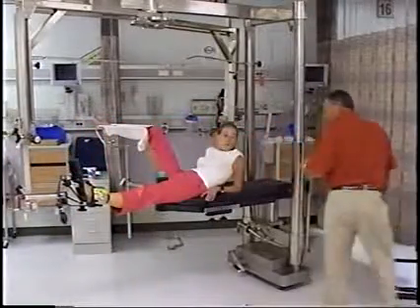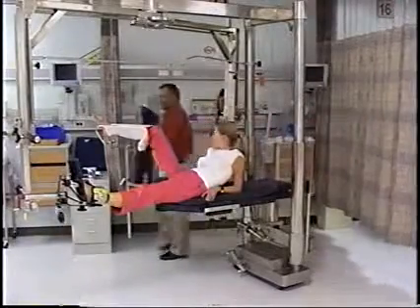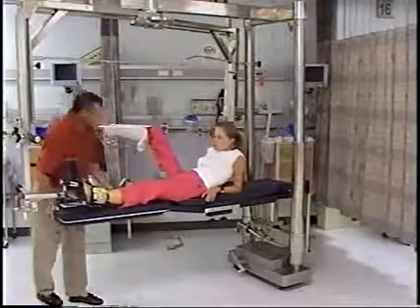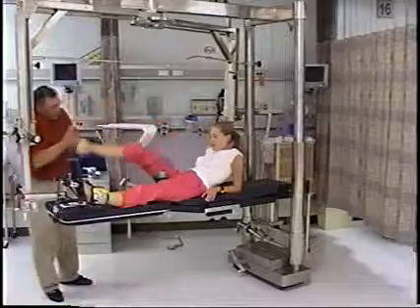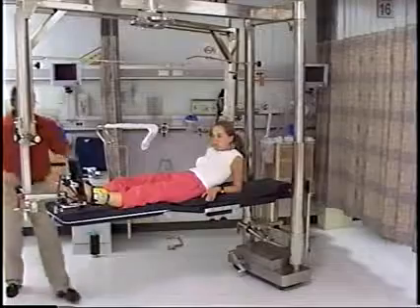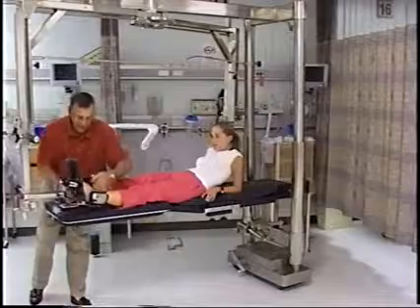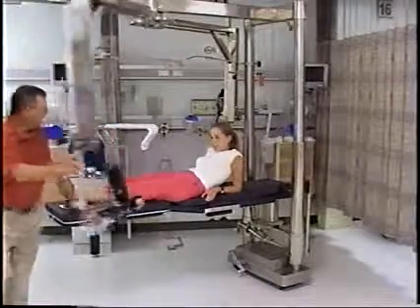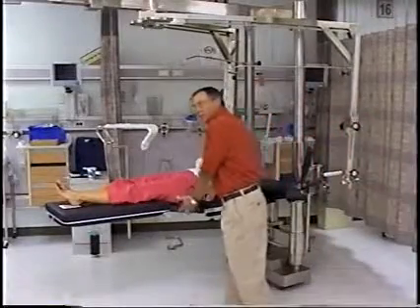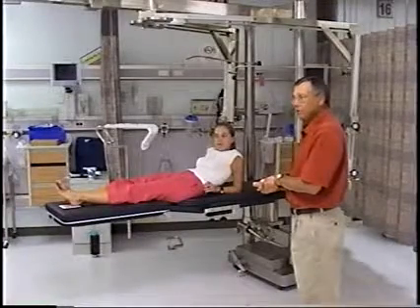So let's assume that Natasha's surgery is over. She's going to walk again. Surgery's over. Doc says, thank you all, I'm going home. This goes back in. Her well leg comes out. The perineal post is taken out. She's taken out of traction. This is moved out of the way. Stretcher comes in, and she's off to her room. Okay. Any questions?